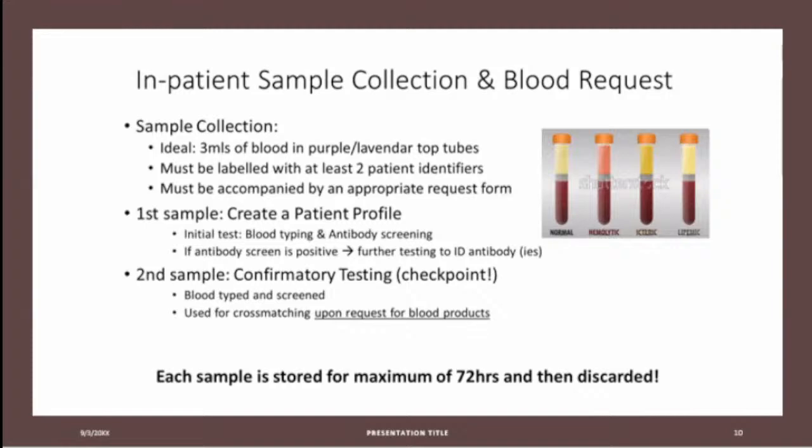Now, transfusion medicine must ensure that there are two distinct samples from a patient. The same blood group must be present in both samples. If we have seen the patient before, we would have a history or historic blood group registered on our software. Then only one group and cross-match sample is required.